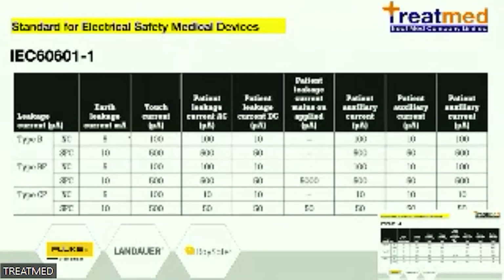For example, touch current is the electric current that comes to the chassis of the medical device, and when we touch the chassis, we can be shocked.